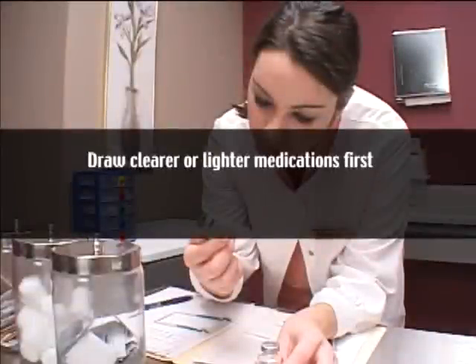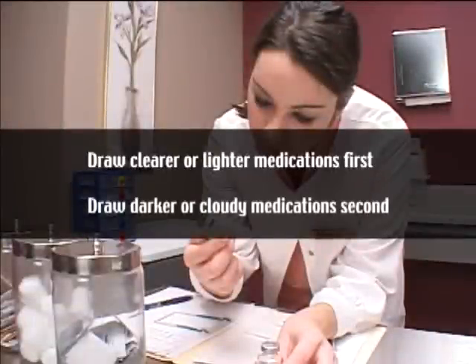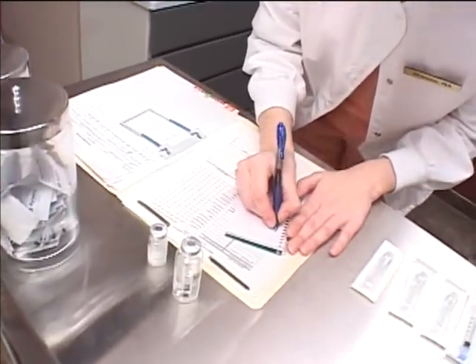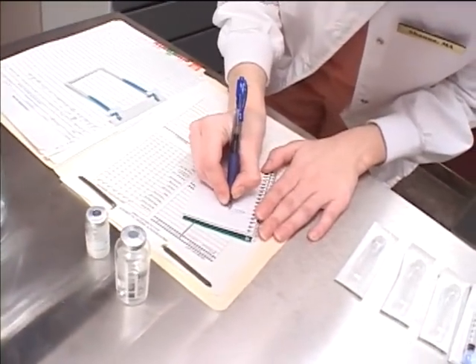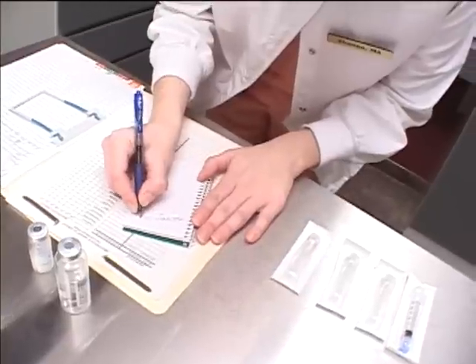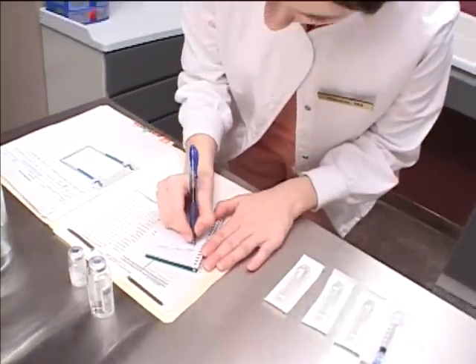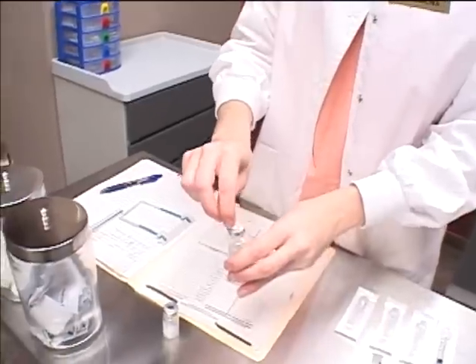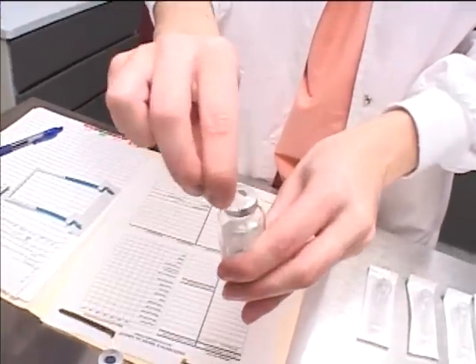The usual standard is to draw up clearer or lighter medications first, and then darker or cloudy medications second. But check the medication insert or with the physician for further clarification. Calculate the dosages for each medication order. Add both dosages together. This will determine how far you pull the plunger back when withdrawing medication from the second vial. Swab the top of each vial with alcohol.